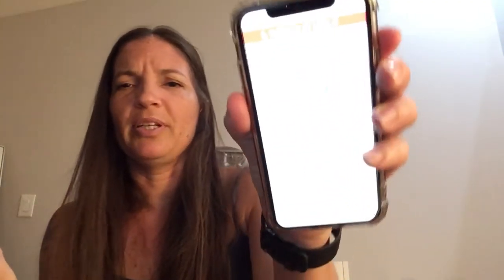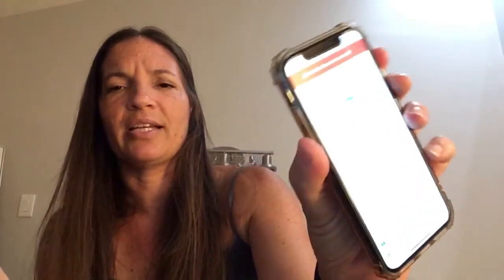The number one troubleshooting thing: if you're trying to get everything back online and things aren't syncing up, first double-check to make sure your transmitter ID has been updated on both devices. I can't show you right now on my phone where to do it, but it's in your app under settings. I've already entered mine and it's still connecting with the transmitter — I had to reinstall my app tonight — but in general it's very simple to go into your settings and go into transmitter ID and change it.